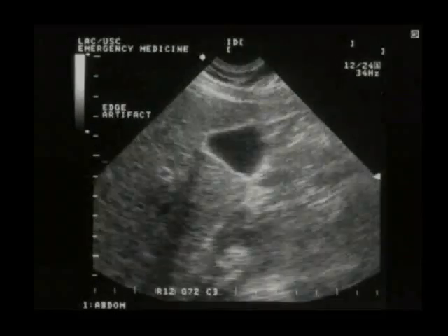Here's a patient, gallbladder that we're looking at, who has edge artifact. You look on the edge of that gallbladder, you see a very small shadow. Okay? We don't want to call that a gallstone. This is edge artifact. We also don't see a hyperechoic area. So if you did think that was maybe a small stone, turn the patient or turn the probe and angle from a different location.